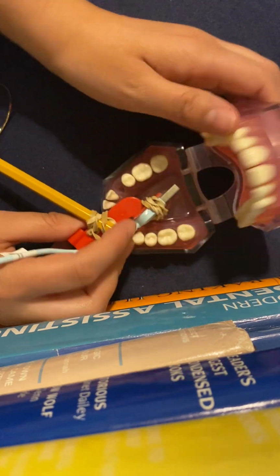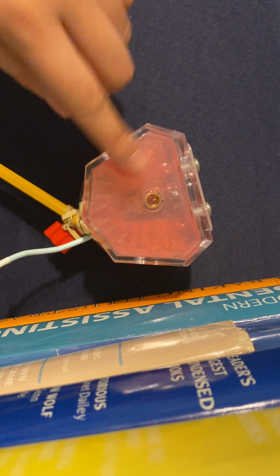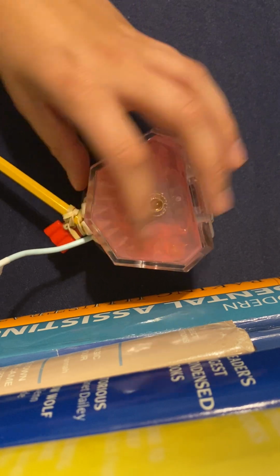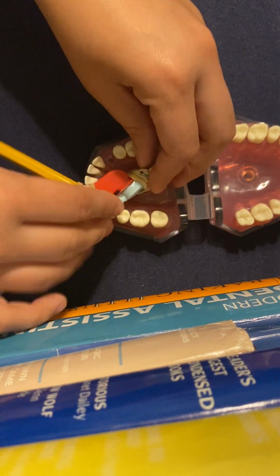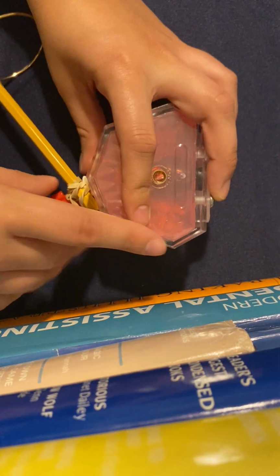Much like that. And the teeth that you're going to want to see in this... Oh no, sorry, I read the molar one. Place the anterior edge at the middle of the mandibular canine. So definitely going to want to get that in there. And for this, you can definitely put more towards the midline of the mouth.